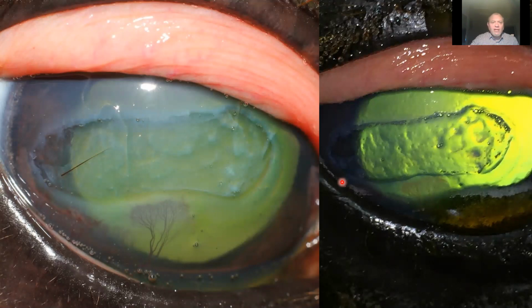Another keratectomy site here, on the right-hand side with just coaxial light, and we can see light passing through this bed of the keratectomy. Then we add in tangential light, and suddenly you can see the surface of the cornea has this white appearance, which helps us to highlight any changes to the anterior cornea. So we're getting information from both sorts of light, both transparency and reflectivity.